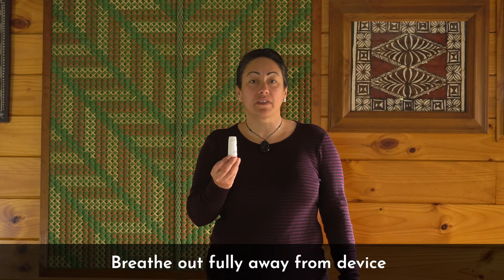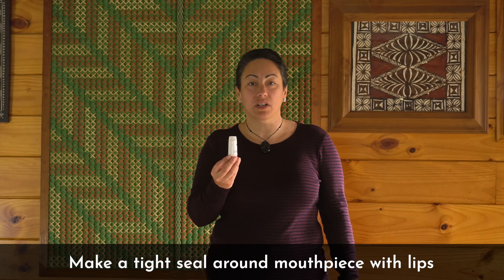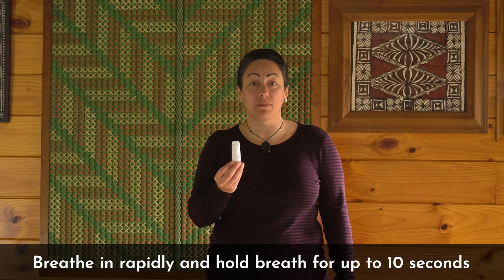To inhale your dose, you will need to breathe out away from your device. Then make a tight seal around the mouthpiece with your lips and breathe in rapidly. Then hold your breath for up to 10 seconds.